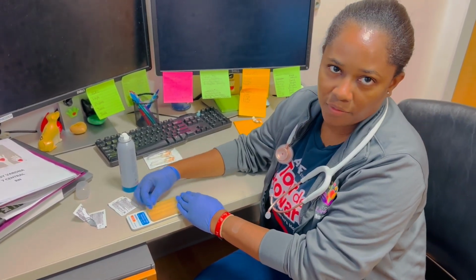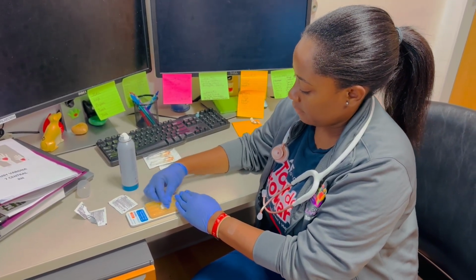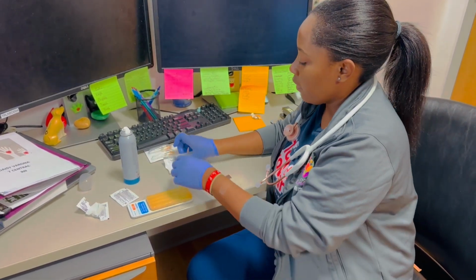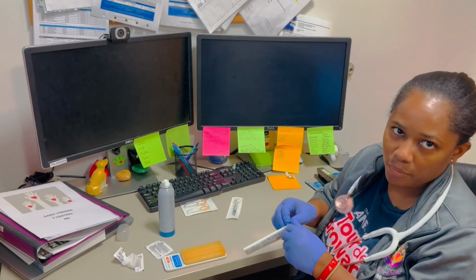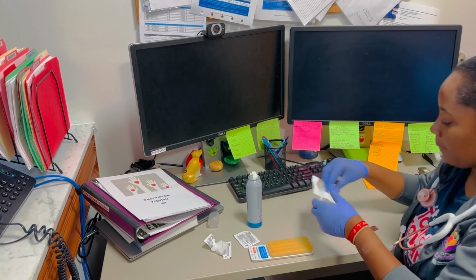You always want to clean a patient for at least a good 30 seconds. Okay, so I cleaned my patient. While this gel dries, remember that you never want to give an injection or IVs or lab draws or anything like that on a wet surface. I'm going to go ahead and let that dry out.